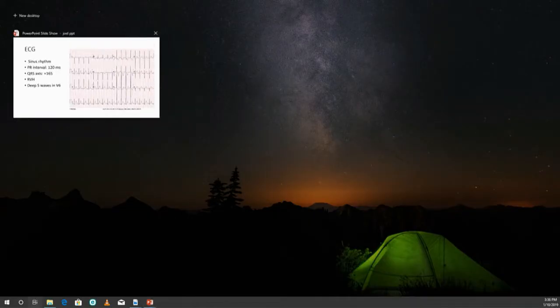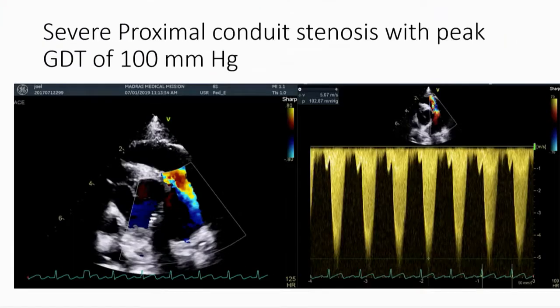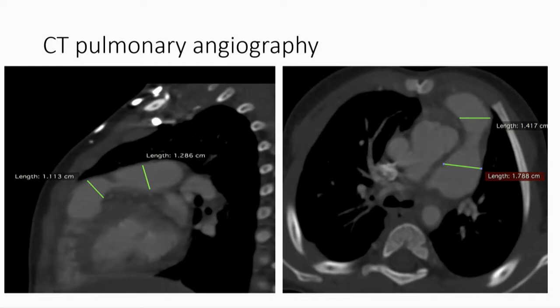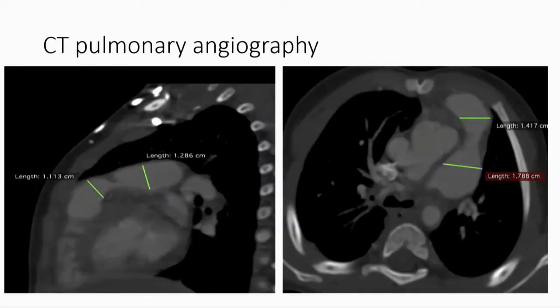Show the CT scan. This is the CT pulmonary angio showing the discrete narrowing. So you can see that the CT is showing a tight conduit stenosis. Basically, the bovine pericardial valve that is inside has become rigid. Show the previous picture, which is like a shelf. It is protruding from the superior end, and that is causing a tight narrowing. And the RV systolic pressure was 40 more than the aortic pressure.